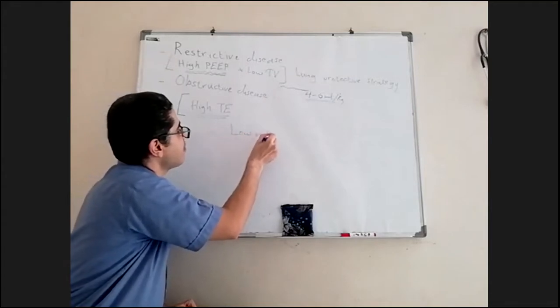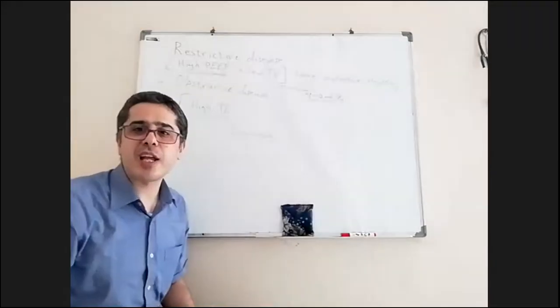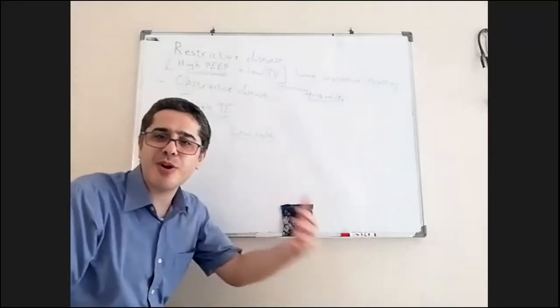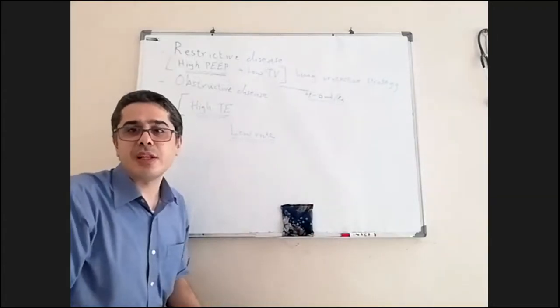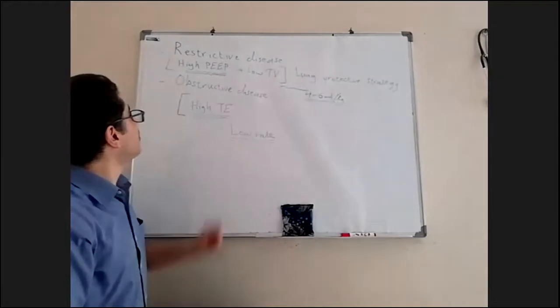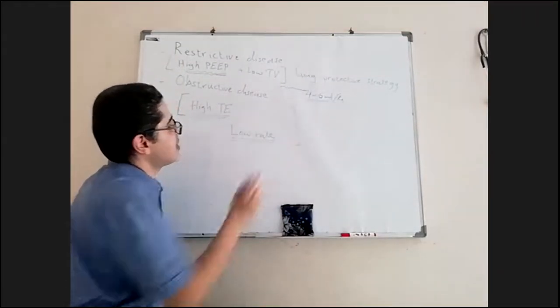I must have low rate. Yeah, without low rate, I cannot get high TE. As you make the rate more, you will get less TE. So keep low rate. So this is the policy in obstructive disease in general.